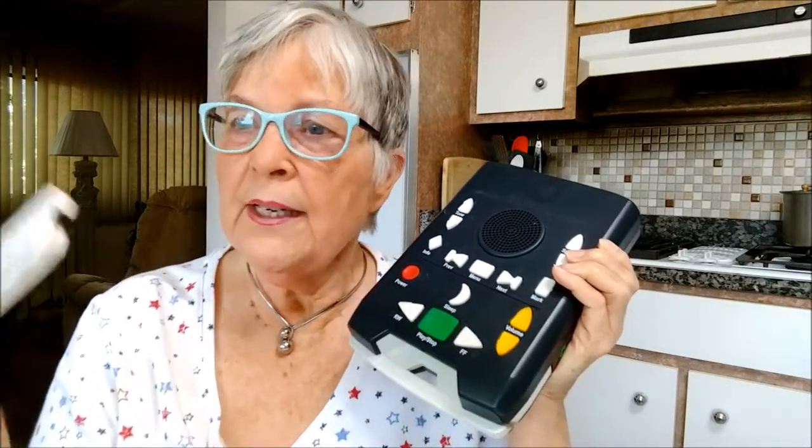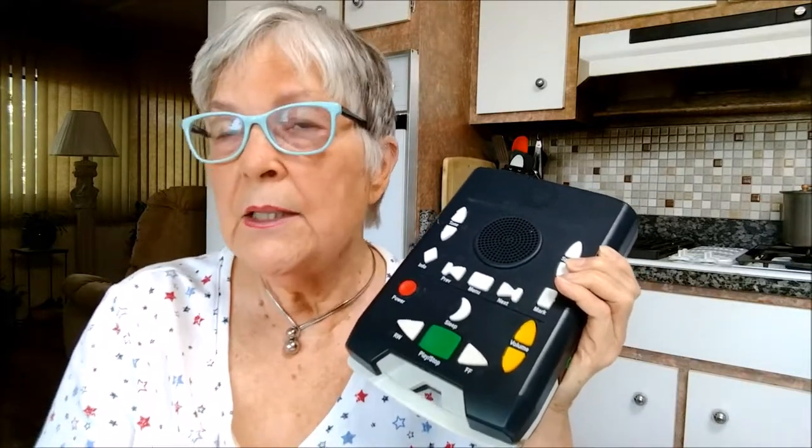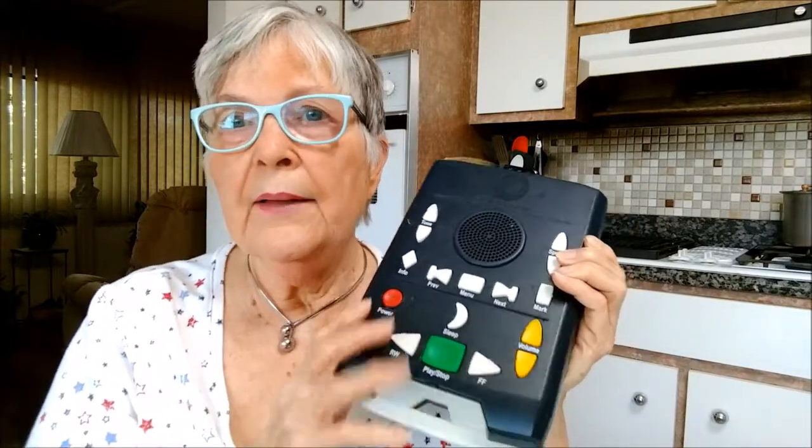When you get these, you have up to five weeks to listen, and they will send up to five of these to you. You can rotate them out — they have their own little cases, and it's free to send them back.